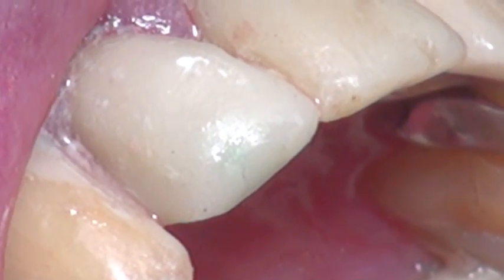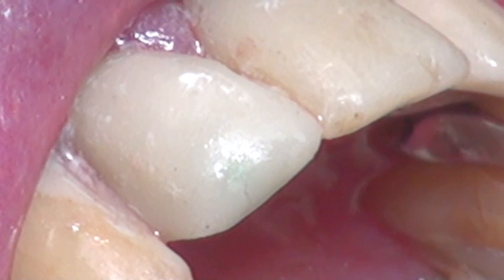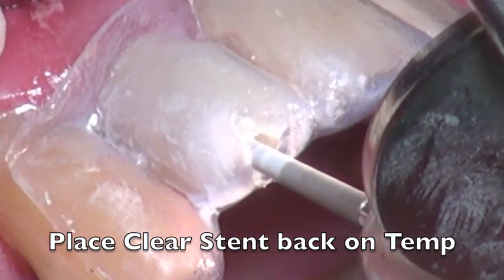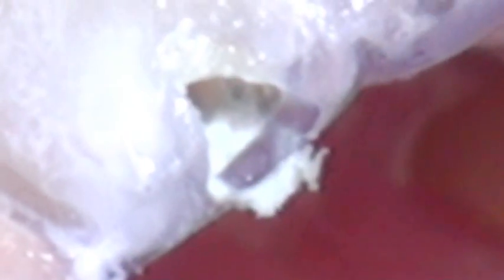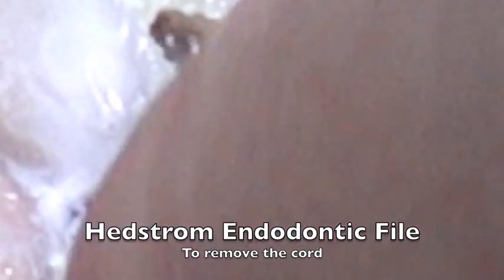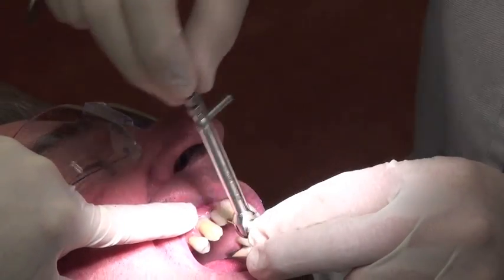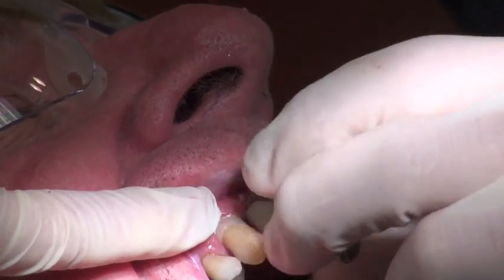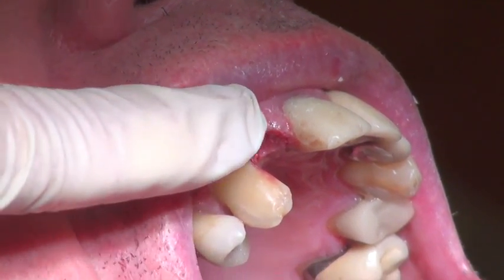Once the crown is on, we can come back and do a crown removal. One of the ways I like to do this is to take the original stent and put it on — this shows you where that original hole was that you went into the abutment, guiding you to the exact position you need to be in. We go in with a diamond burr — an 8850KR red stripe diamond — and find that cylinder. Once we find the cylinder we use a hedstrom file, which likes to grab onto anything, to pull out that cord quite easily. Once the cord is out, you're able to remove the temporary crown and get back in there to start your impression technique. It works quite well, and you can see here is an x-ray showing the impression coping on top.